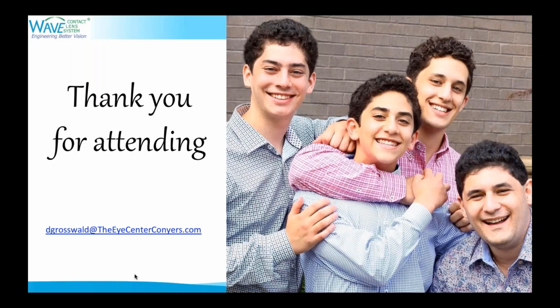with WAVE, how do you address a pinguecula? Sure. So with WAVE, I'll be very frank with you. If it's a mild pinguecula, then we generally will vault over. The Pentacam design lenses are doing a better job of making allowances for that. It will change the sag value at that area.